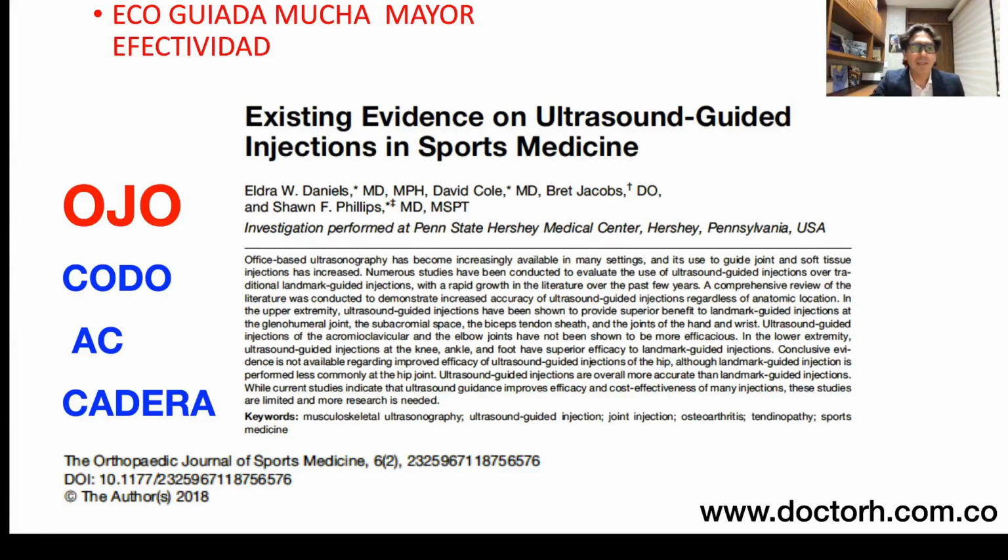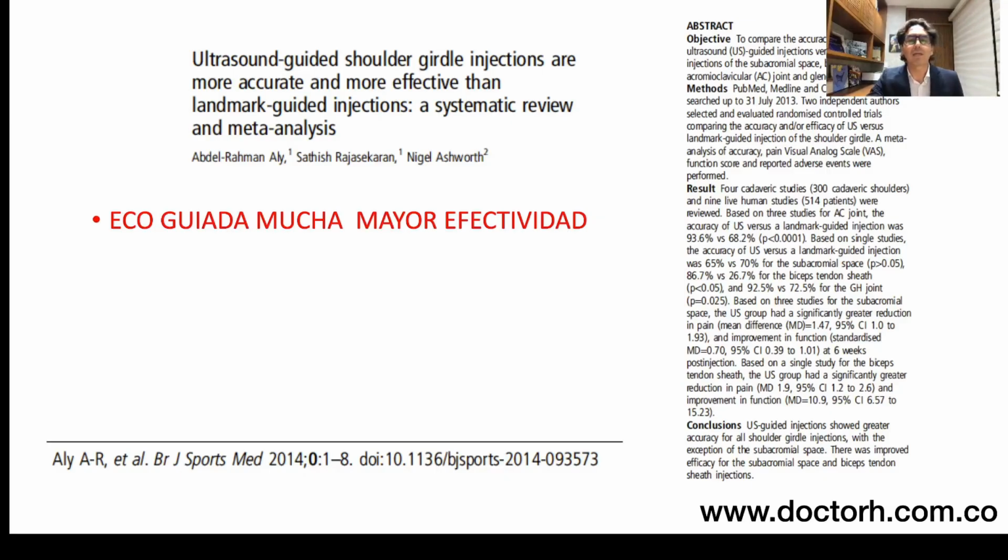In sports medicine in general, nowadays I also want to pose a question. Who does a hip injection without ultrasound? Extending that to other areas, if you already know how to use ultrasound, then why would you really do it without it? There's a lot of evidence telling you to use it. So if we have the evidence, I think we should use it.